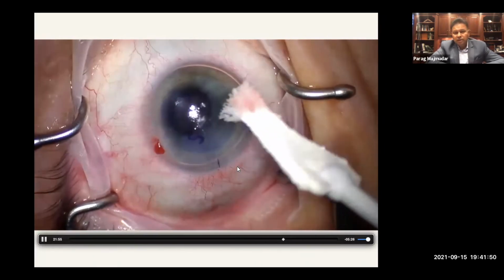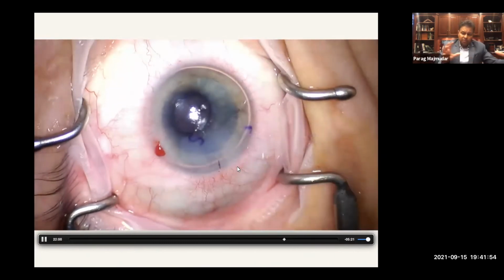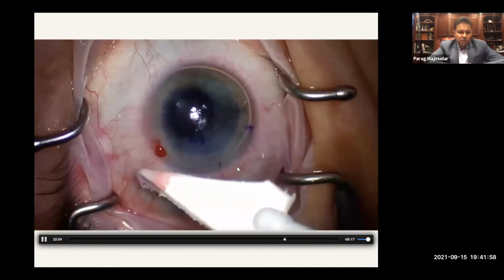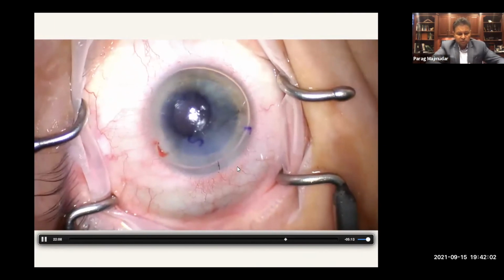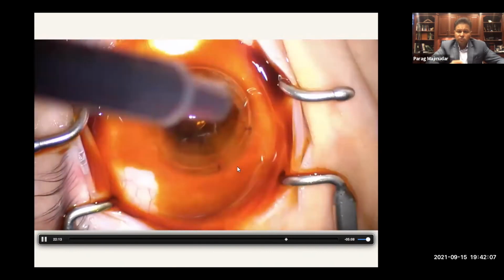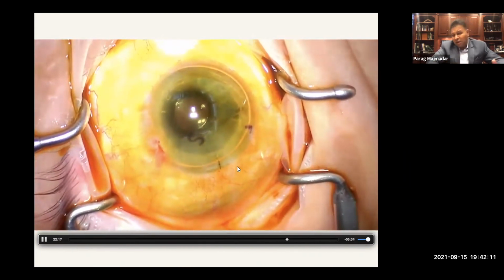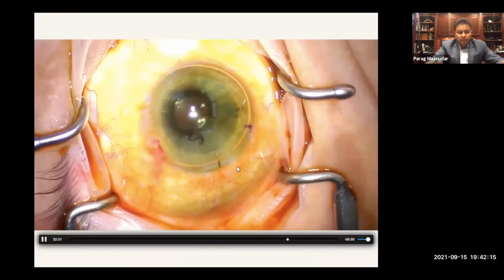Well, then 2 o'clock in the morning, she called again saying, I'm in a lot of pain. And she had completely filled up again. The bubble was 100% again. So I think it's really important to make sure that when your staff in the OR is diluting SF6, if you're using SF6, to make sure that you're using the right concentration, a non-expansile concentration. I used to use 20%. Now I'm using 15%. It probably lasts a little bit less long, but you may get potential issues.